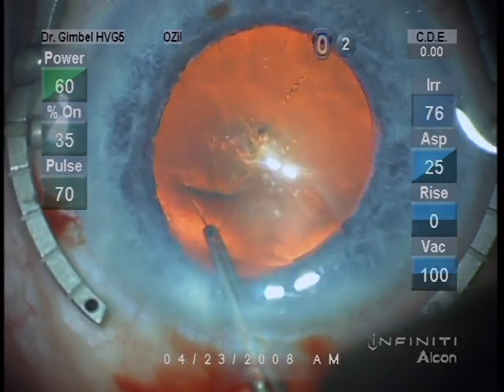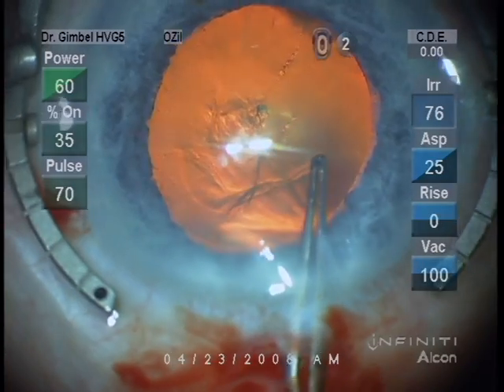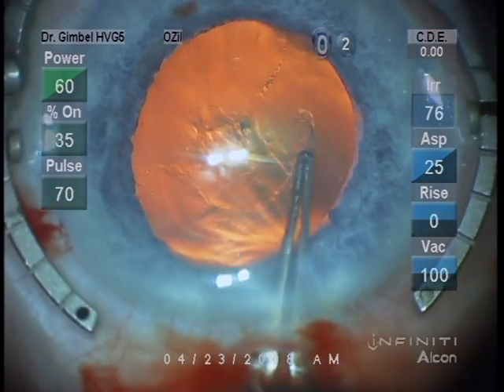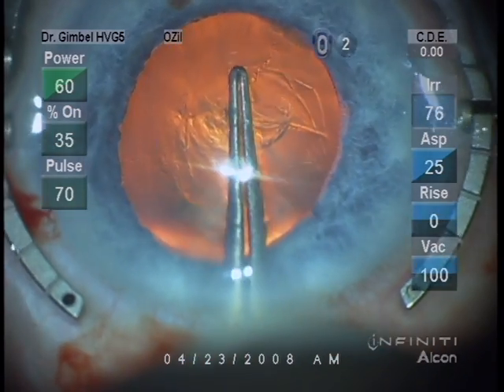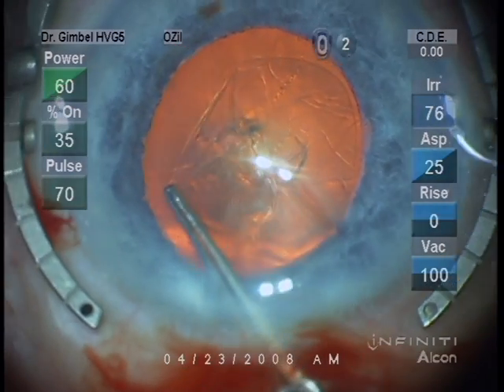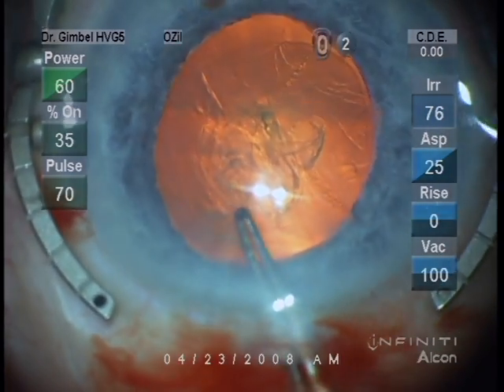It's important to size so that optic capture, or rhexis fixation as Tobias Neuhen termed it, can be utilized if necessary, if the posterior capsule is compromised.